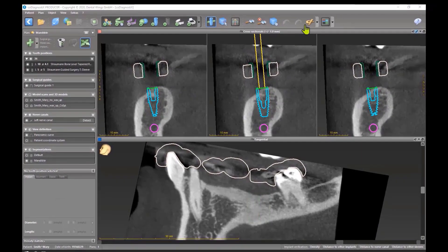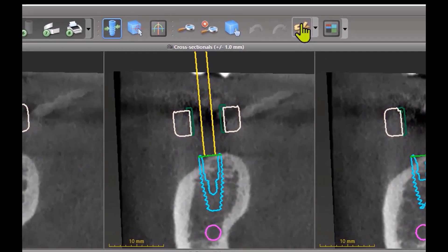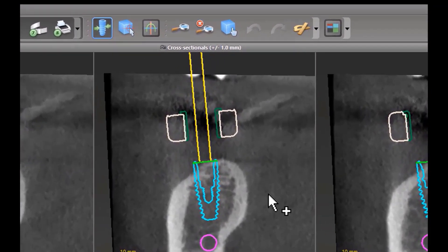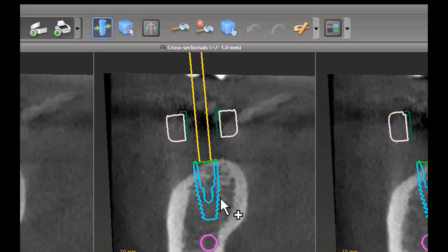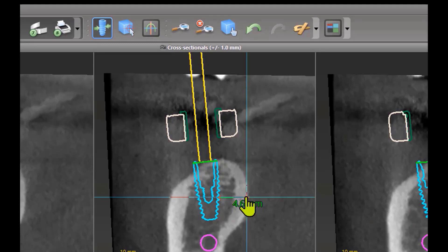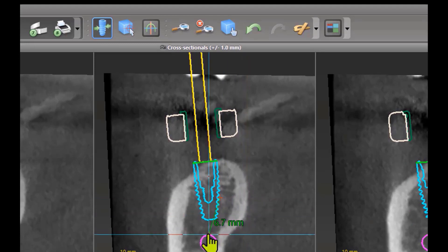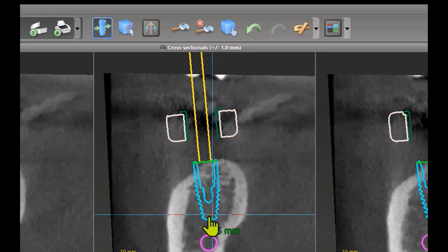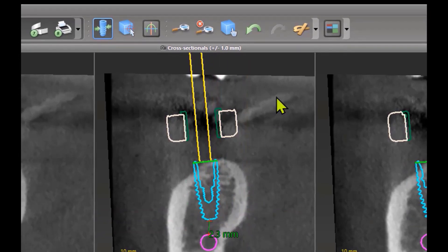To make measurements in co-diagnostics, click on the measurement button. You will have a plus on the right side of your cursor. Left click to start, left click to end, and you have an active measurement, which means you can move the crosses to other situations.